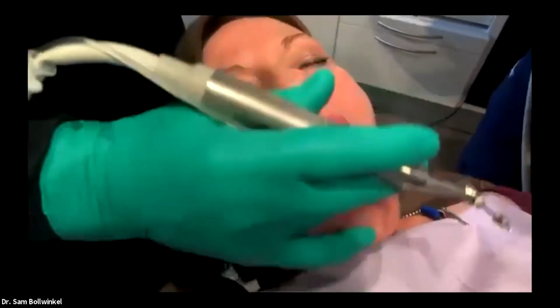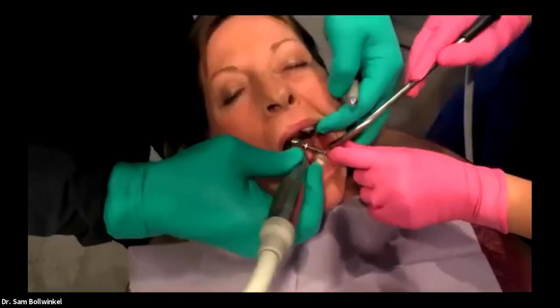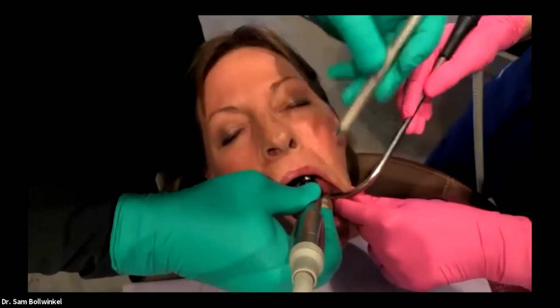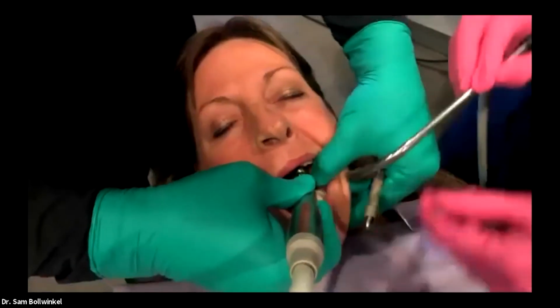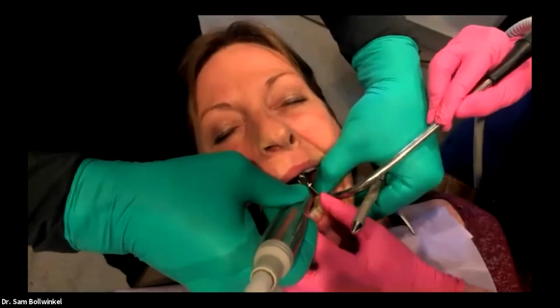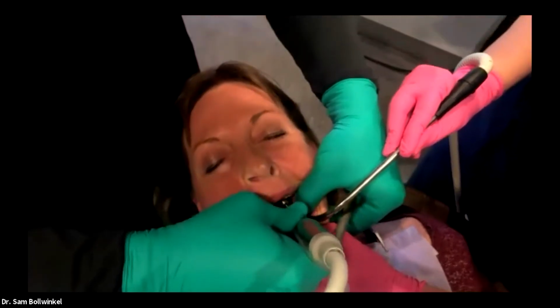All right, Carrie, so we're using some saline water as well, so it has that nice salty flavor. And we're going to take our osteotomy drills. Let me see if I can get the seat there. Good. I'm going to come in here. Good, I'll have you just hold that there. Perfect. Good job. Okay, so literally we're just going to do our osteotomy here.